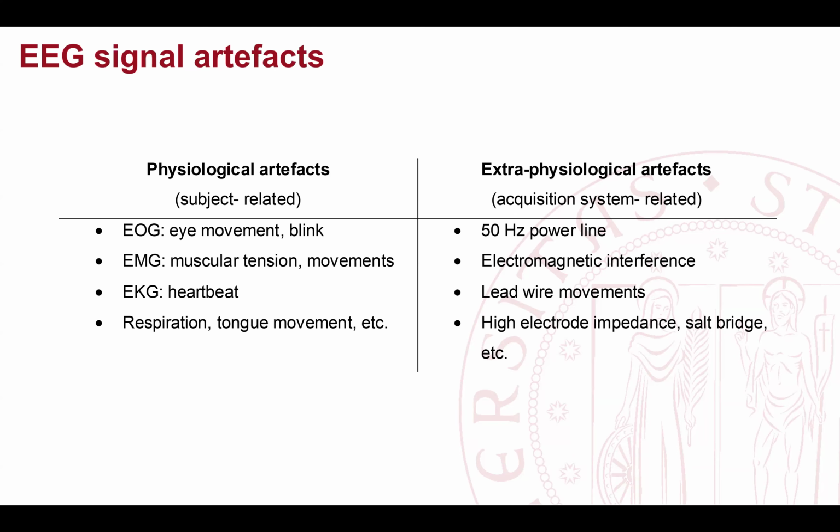But other things, like tongue movements, if you swallow, if you inspire, everything can be seen in the EEG signal, and these are artifacts. So we have to remove them. Is it easy to remove them? No, it is not.